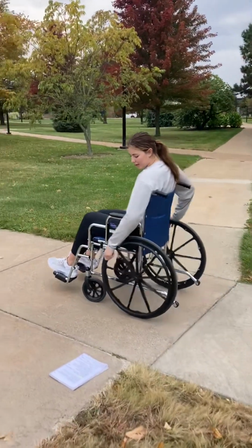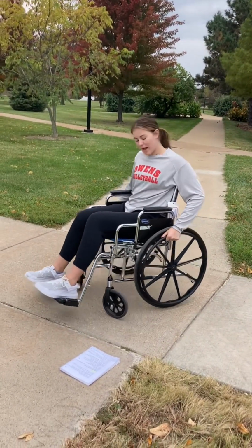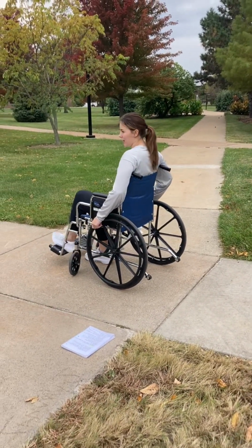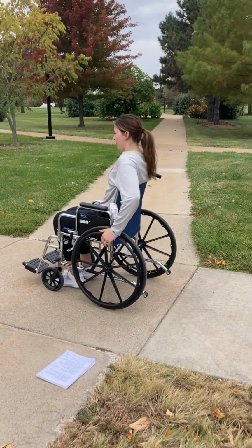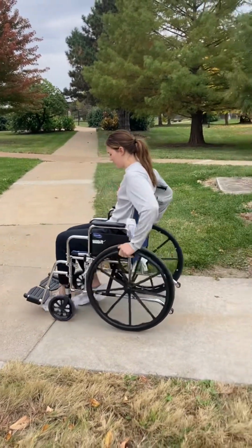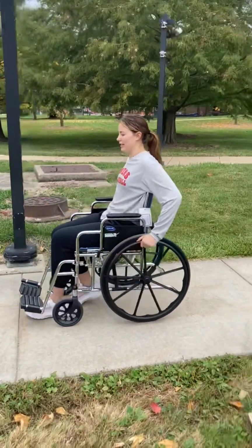And then for ascending backwards, you want to use your feet if you can, and you want to apply equal force on both rims while you go backwards, and you can use your feet to go up like this.